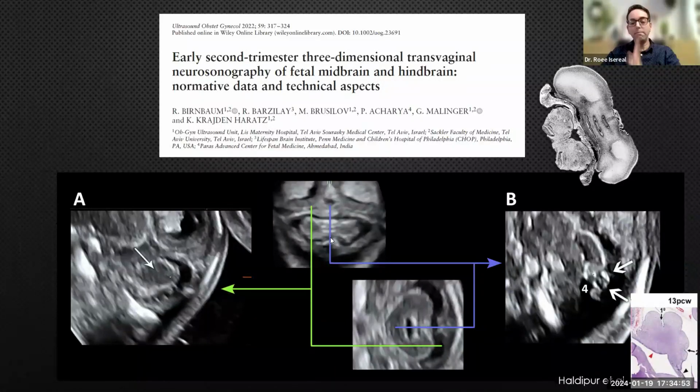And if you perform a mid-sagittal section through this area, on the mid-sagittal view, you see these tiny reflections along the vermis, which are not present if you're cutting on the parasagittal plane through the hemispheres. As you can see here, it is smooth and isoechoic. So remember this point: if you're insonating correctly, you should be able to visualize the early vermian fissures after 14 gestational weeks, as we showed in our study.